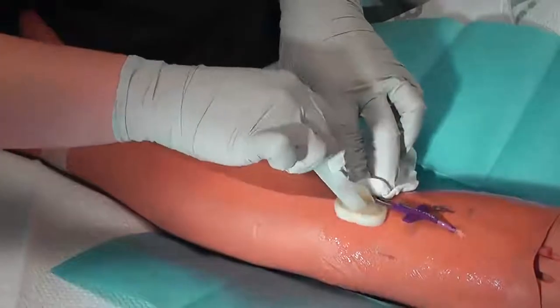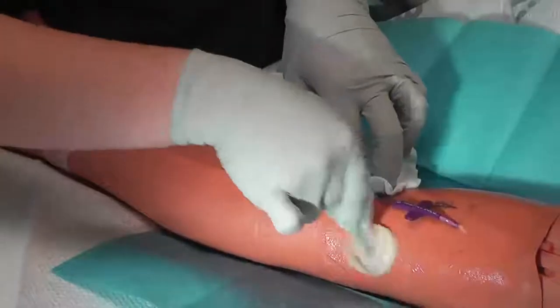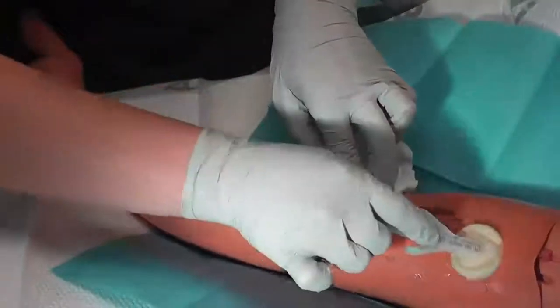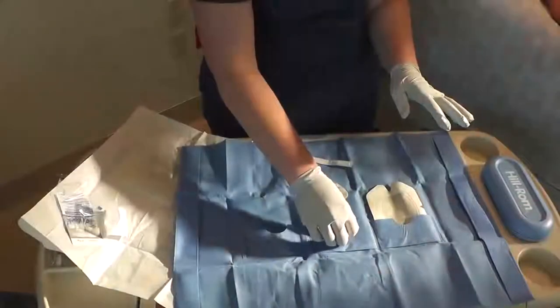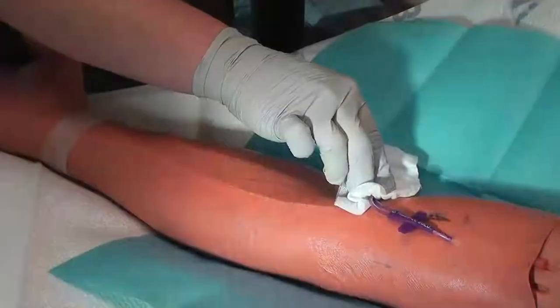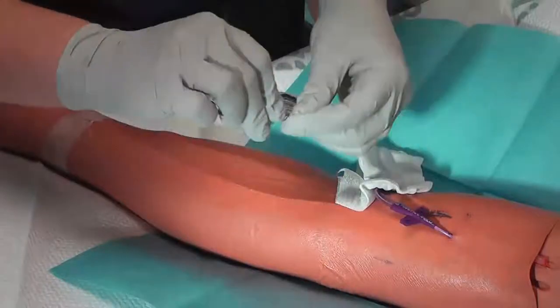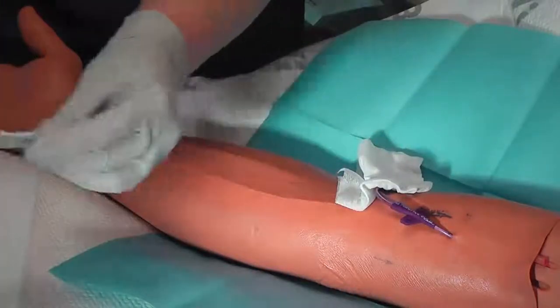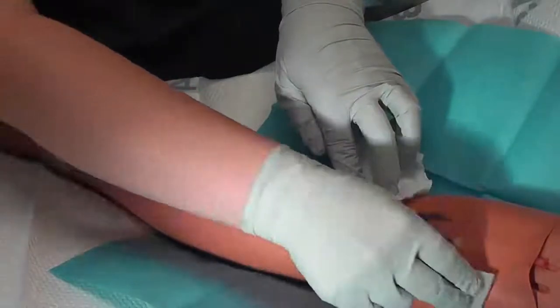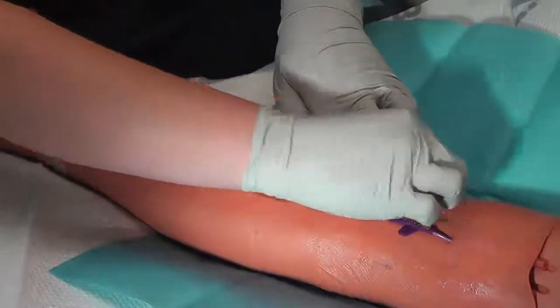Allow time to dry completely. Apply skin prep to the area where the statlock will be located as well as the area the dressing will cover. Avoid the insertion site and the catheter, as any skin prep applied to the catheter wings will make it extremely difficult to remove the dressing on the next change. Allow skin prep to dry completely.